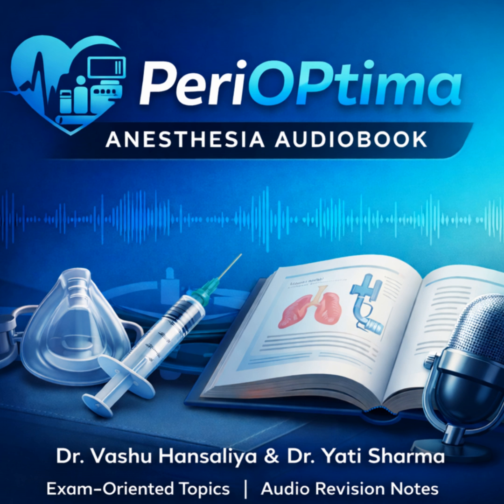This should be the highest peak on the screen if the device is working well. And the third one? The third one is the assisted systolic pressure. This is the systolic beat that comes after the balloon has done its work. And what should that assisted systole look like? This seems like a key point. It should be lower than the unassisted systole.